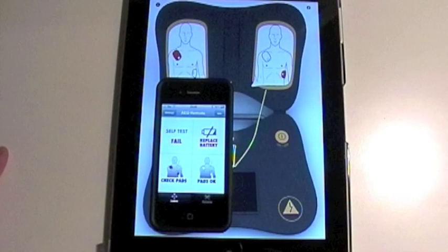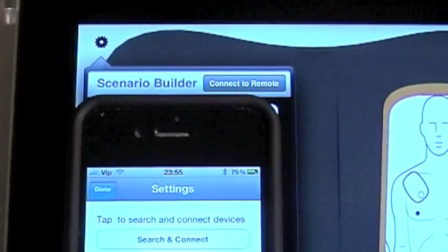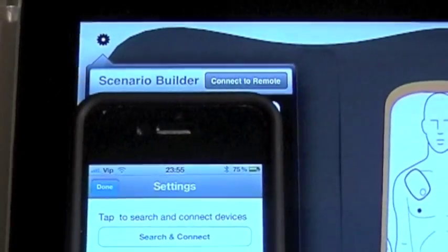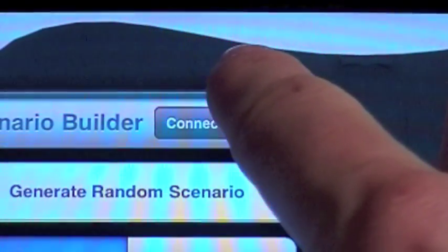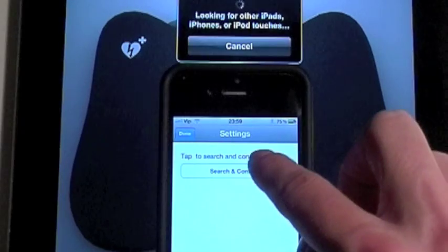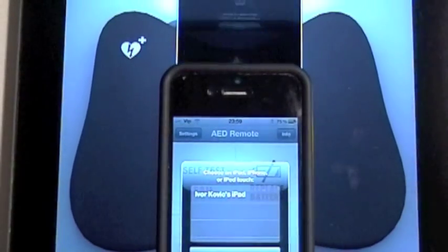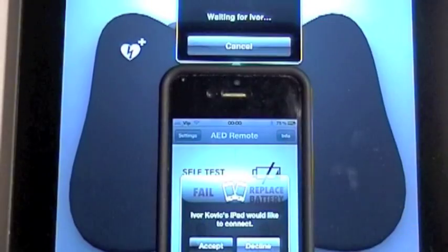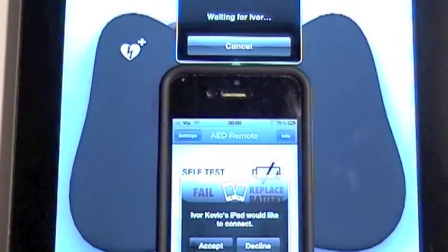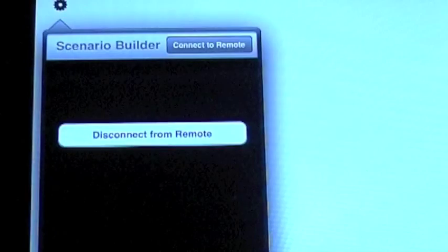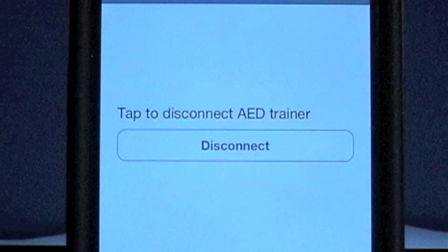After starting both the AED Trainer app on the iPad and the AED Remote app on the iPhone, you need to tap on the Settings button and then choose Connect to Remote. Devices will automatically search for each other and once you select them from the list, you just tap on Accept. The only thing you will see now in the Settings menu is the Disconnect button, since all the controls have now been moved to the iPhone remote control.